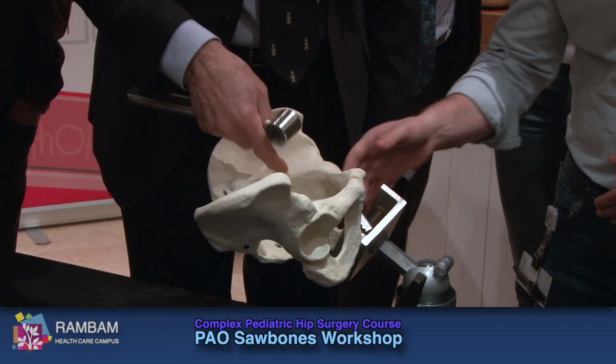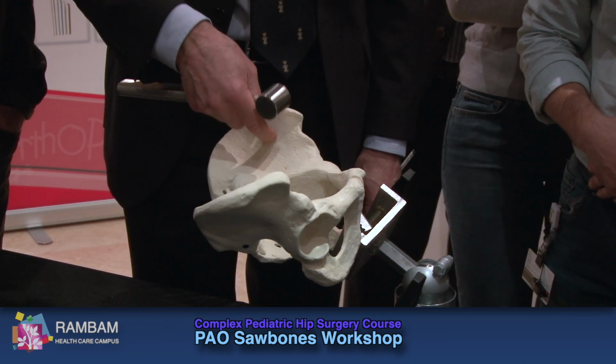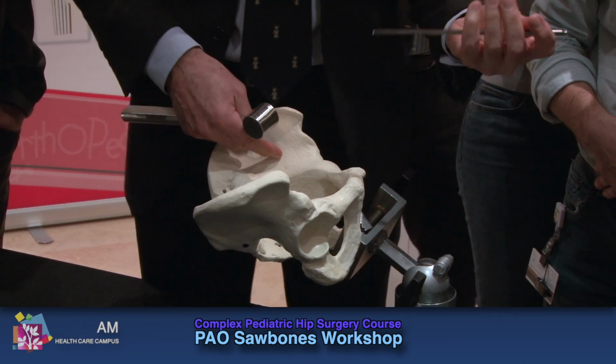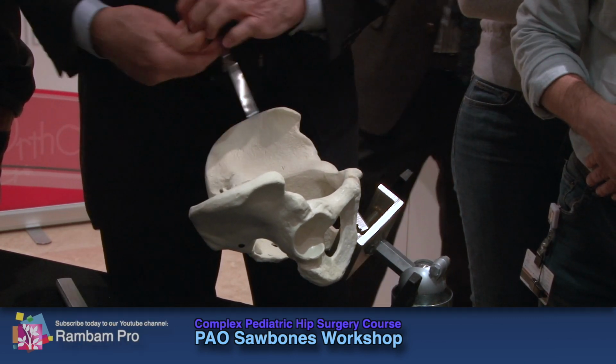The perforating vessel from your internal vessels comes into the ileum over here. Sometimes you get a lot of bleeding here. If it's bleeding through the bone, you can take bone wax. You just crack it into the foramen to stop the bleeding.